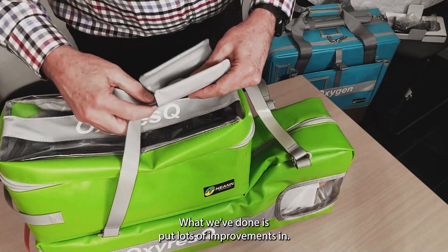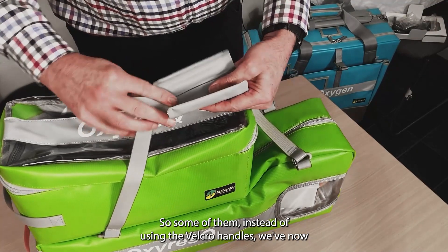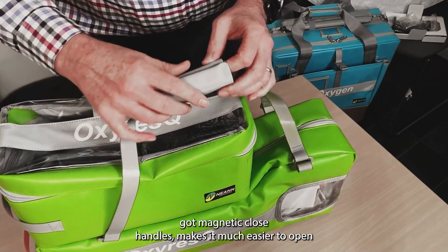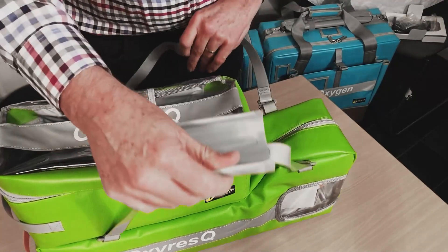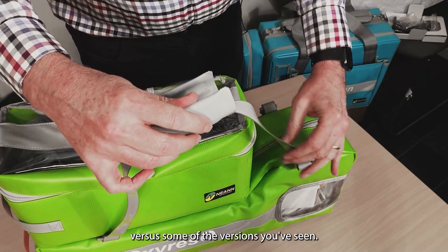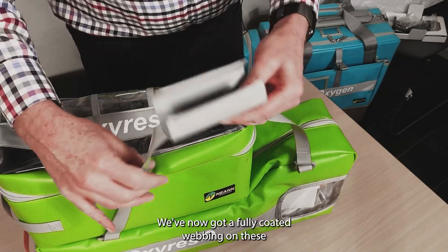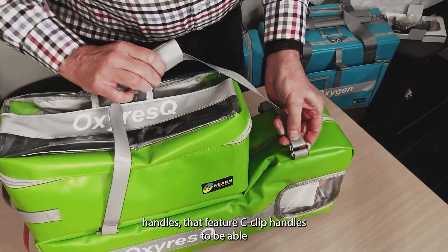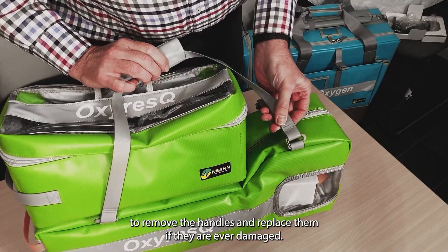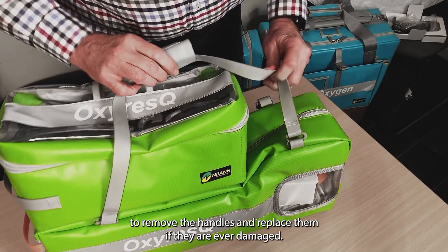We've put lots of improvements in. Some of them are: instead of using the Velcro handles, we've now got magnetic close handles, which makes it much easier to open the straps. We've also got a fully coated webbing on these handles.